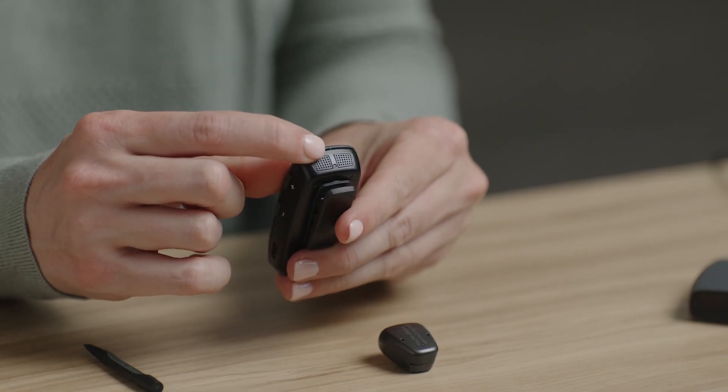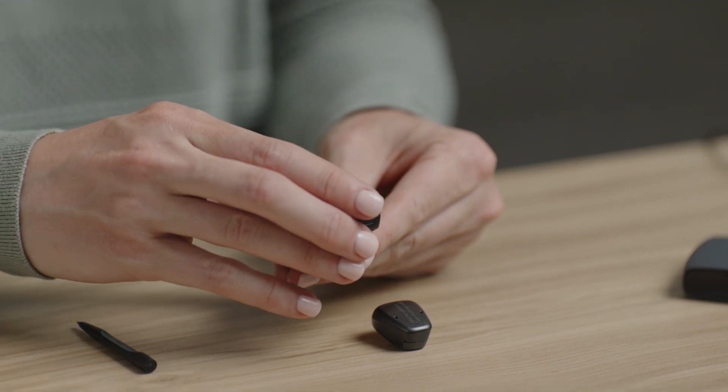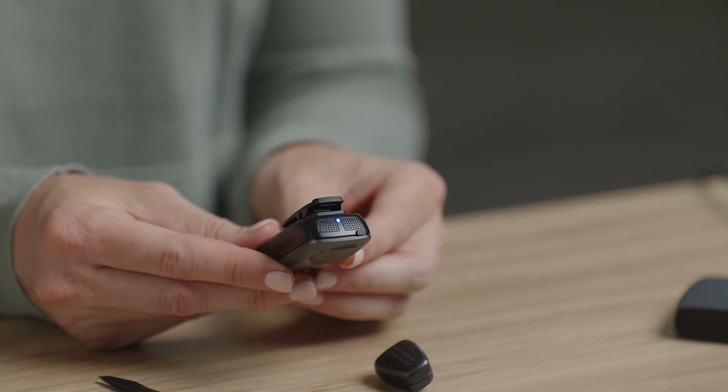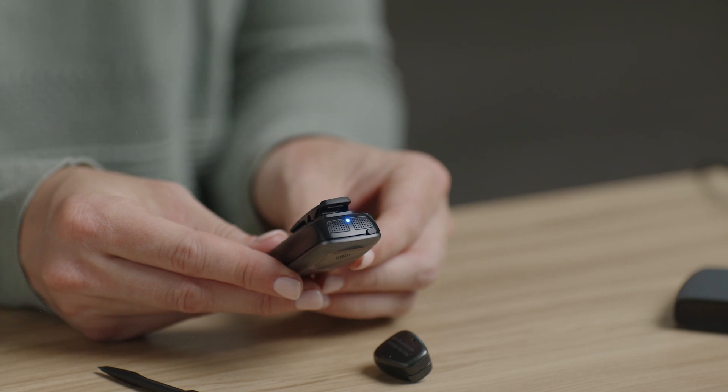Next, turn on the MultiMic Plus by pressing and holding the power button for two seconds. The light on the device will flash green every two seconds to indicate it is on. Now that both your processor and MultiMic Plus are powered on, let's pair them. Remember to maintain two inches or less of distance. Using a pen tip, press the small white pairing button on the back of the MultiMic Plus. The light will flash blue to confirm it is in pairing mode, then turn solid blue to indicate successful pairing. If you have two sound processors, it will flash blue again and then turn solid blue to indicate successful pairing to the second sound processor.